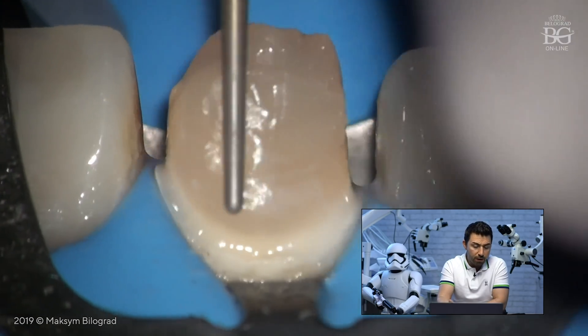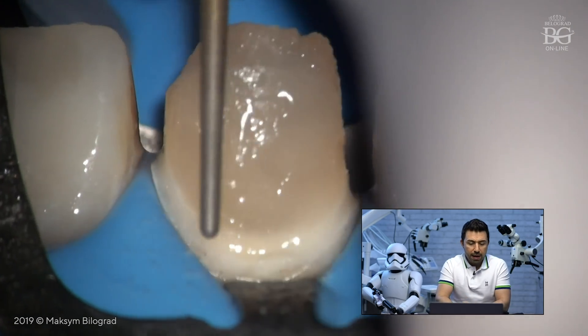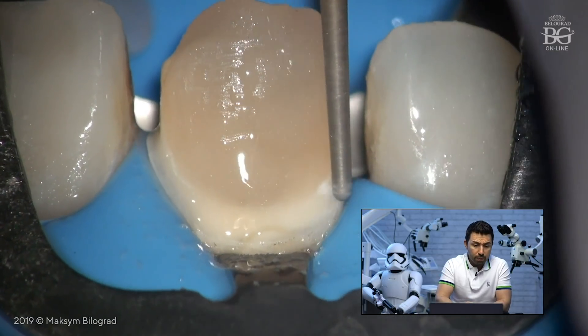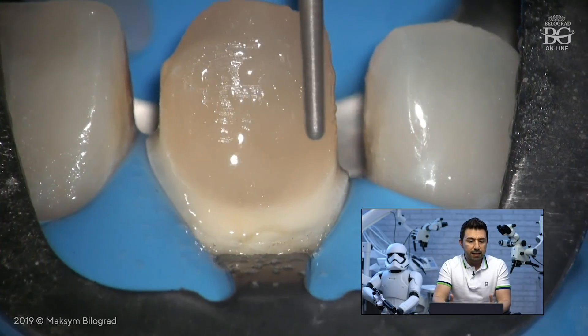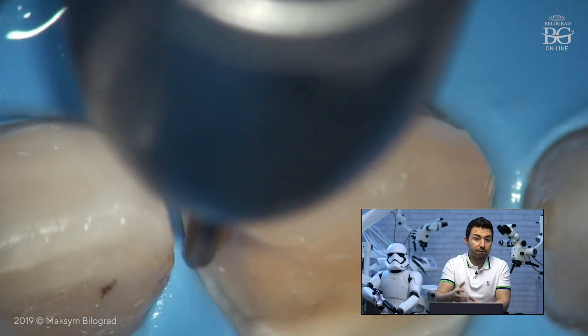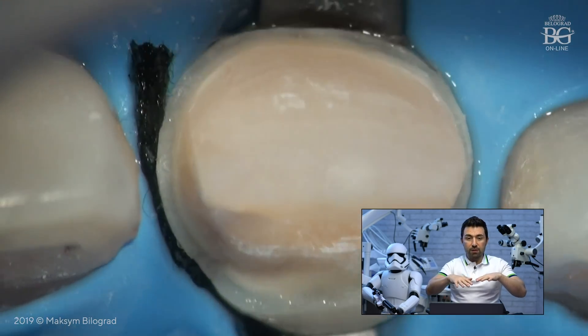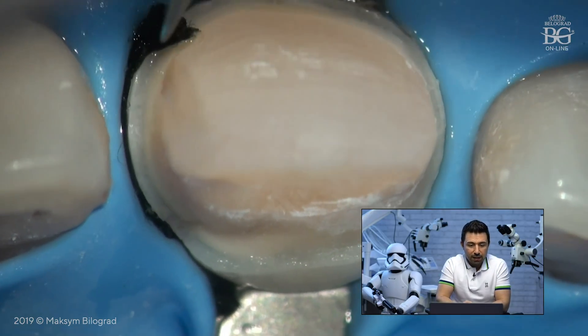We continued and prepared the tooth with rubber dam still in place. I am very comfortable doing preparations with rubber dam. The benefits: controlled preparation, no bleeding, no soft tissue interference, really good contrast, a lot of light, and full access to manipulate the burr all around. One trick from the palatal side: there is a crack and I have to prep until the finish line is beyond the crack line. But the rubber dam can be too coronal and create a helicopter effect. To avoid this, pack a retraction cord or teflon tape to move the rubber dam slightly apically, then continue the preparation.